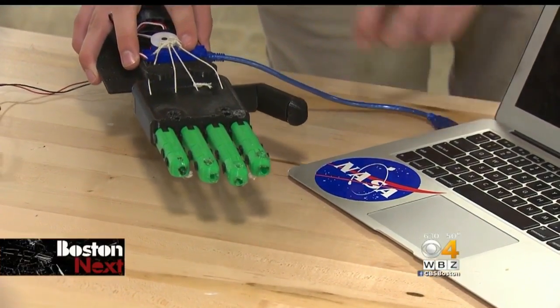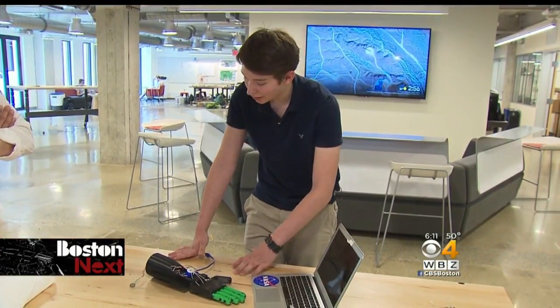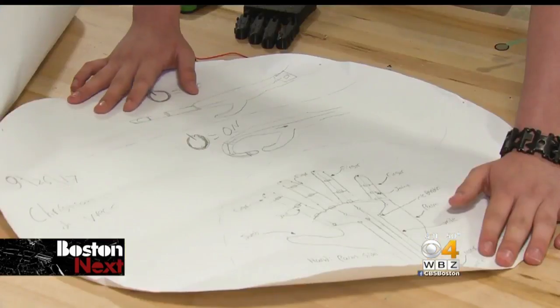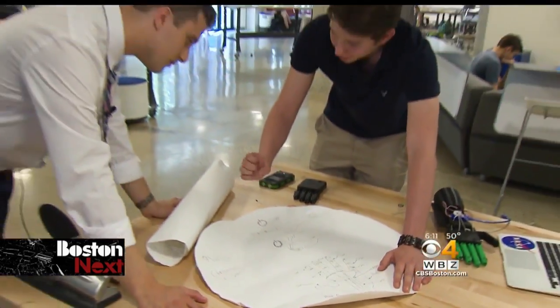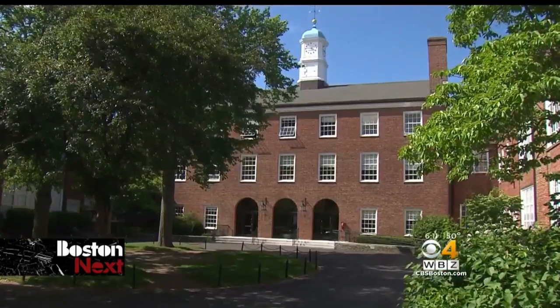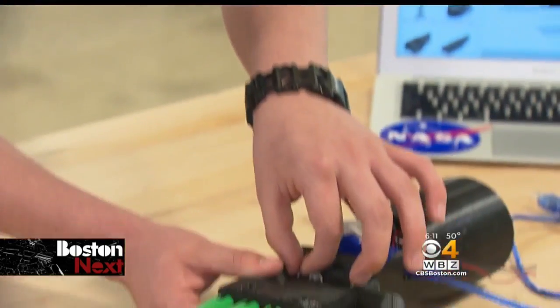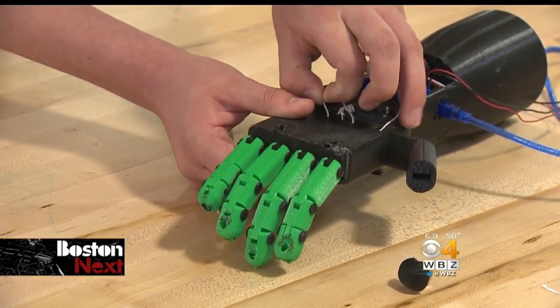So if I plug it in and then press down on the sensor. His laptop has a NASA sticker on it, and Christian Nevek might very well one day work there. This sketch right here is the very first one I did. Right now, he's at Beaver Country Day in Chestnut Hill, perfecting his design of a prosthetic hand. He wants disabled classmates to have an affordable option.